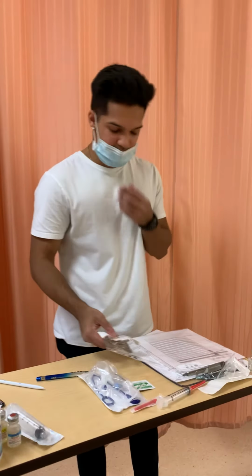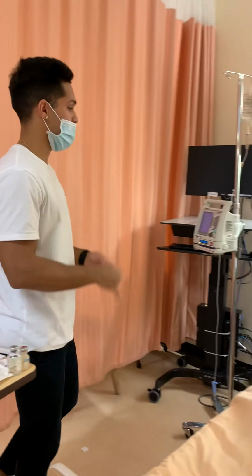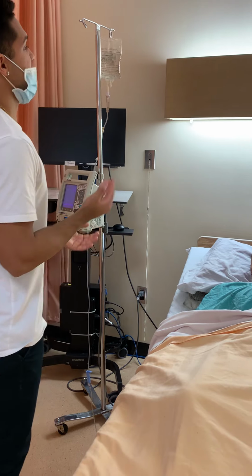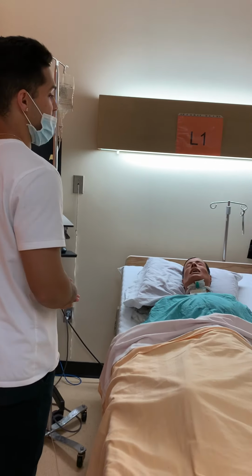Okay, so now that I've done my third check, I'm just going to be doing some patient education. Okay, Mr. Wrightson, I'm going to be giving you your cloxacillin today. Your cloxacillin is an antibiotic for the cellulitis you have. Some side effects you might experience regarding this medication are diarrhea, nausea, maybe a hypersensitivity reaction.